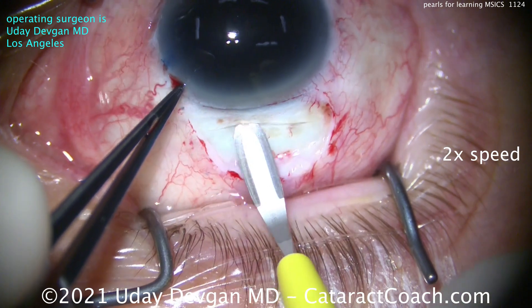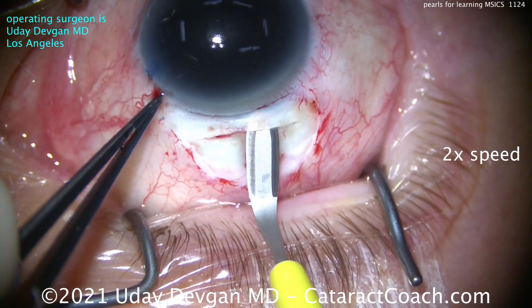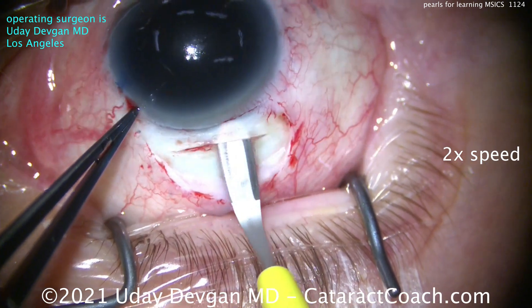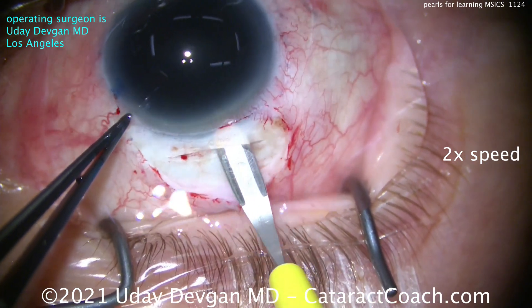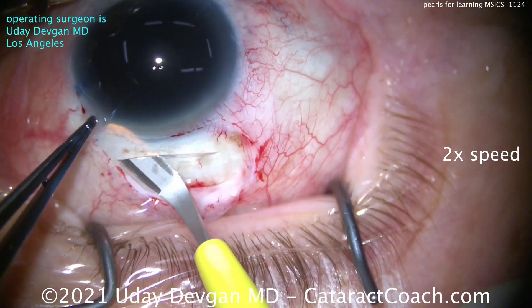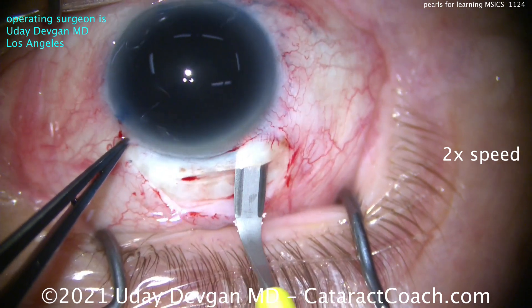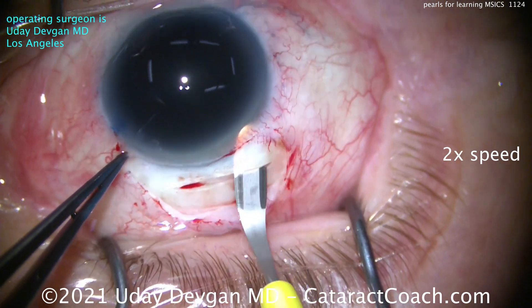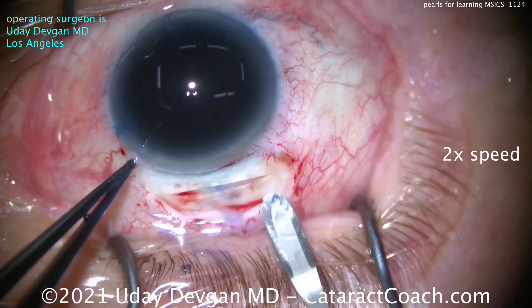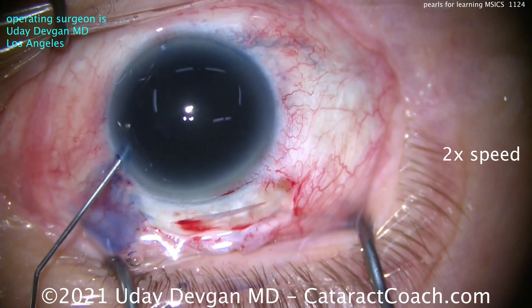This patient has slightly thinner sclera than normal because he's very myopic. He's going to receive a minus three diopter IOL for a post-op outcome of minus one, and has an axial length of well over 30 millimeters. Look at that trapezoidal shape — making the incision wider internally than externally. Notice we have not yet entered the anterior chamber.